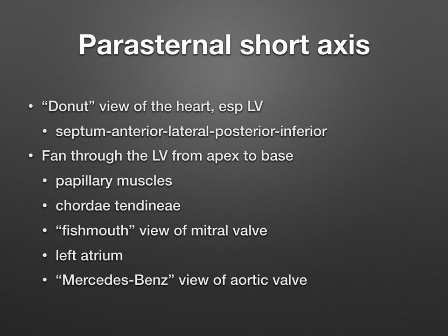You want to fan through the left ventricle from the apex to the base, identifying the papillary muscles, the chordae tendineae, the fish mouth view of the mitral valve, the left atrium, and the Mercedes-Benz view of the aortic valve.